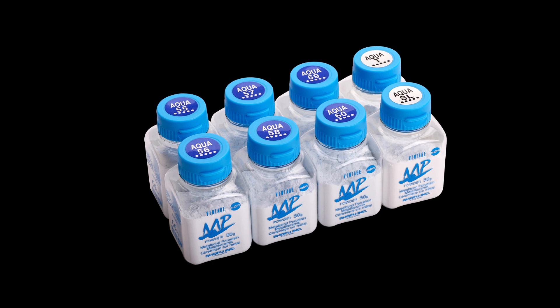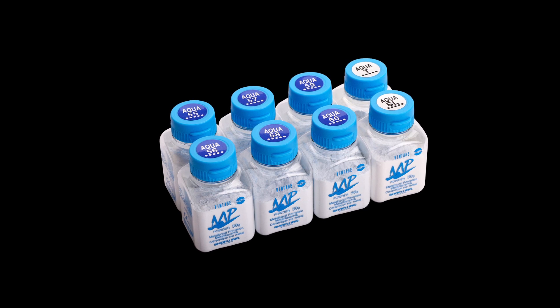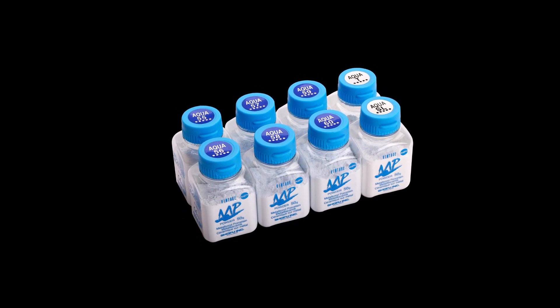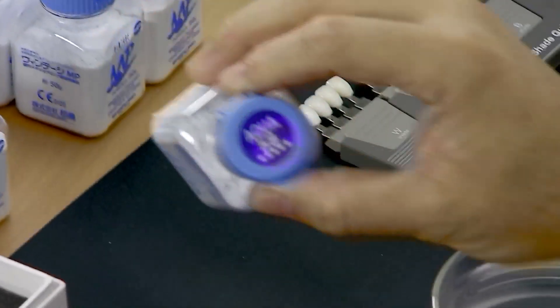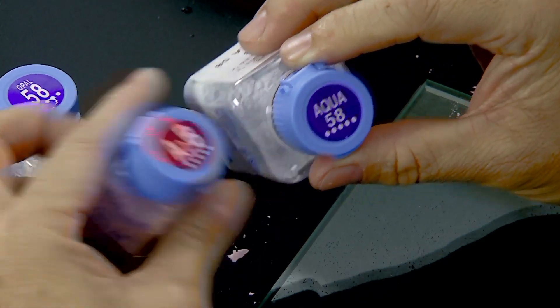The enamel layer is built up with the corresponding opalescent enamel porcelain. The newly developed Vintage MP Opal Aqua enamel is ideal for cases where higher translucency is required in the enamel layer while maintaining the opalescence of natural dentition. To match the body porcelain A2B, the enamel layer is recreated with Vintage MP Opal Aqua 58.